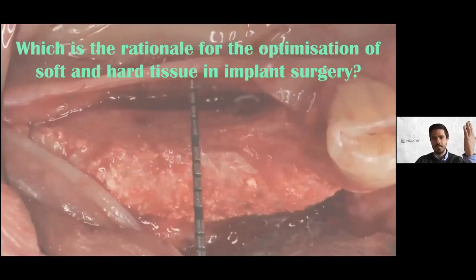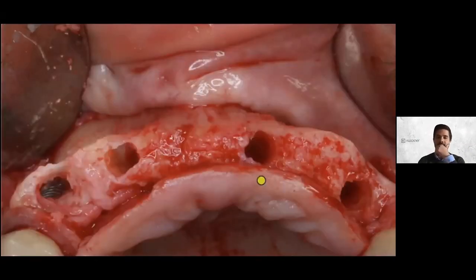Which is the rationale for the optimization of soft and hard tissue in implant surgery? What is the reason in which we have to go for augmenting the soft and hard tissue in implant surgeries? Because we have situations like this. It's a pristine bone in which we have drilled the bone, and we have cases like this with a quite thin buccal bone thickness after the drilling. And also we have quite wide thickness when we have drilled the bone.